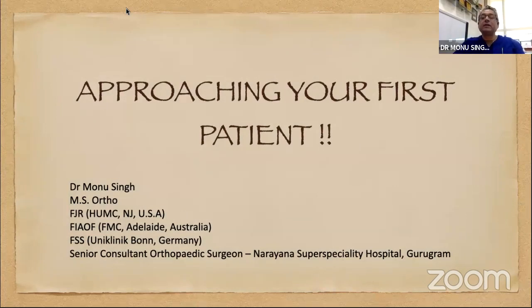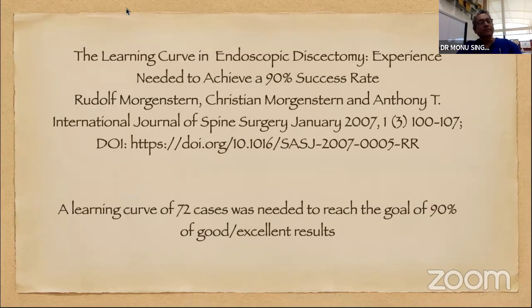So good afternoon, everybody. These are very few slides and I will just take 5 minutes for this presentation. I'm going to be talking about stuff which I faced in my initial few cases. When we talk about endoscopic discectomy by whichever means, whether it is microendoscopic, tubular, or Destandau or any other system, there is a certain amount of learning curve involved in getting to know these techniques properly and to be able to deliver the desired results to the patient. Now, this learning curve by no means is a small one. You need at least 70 to 100 cases to reach that level of proficiency.